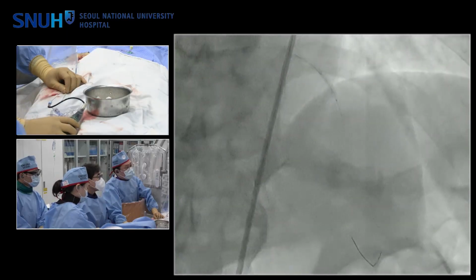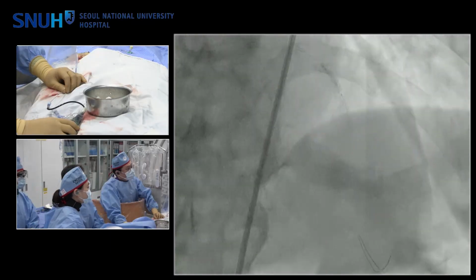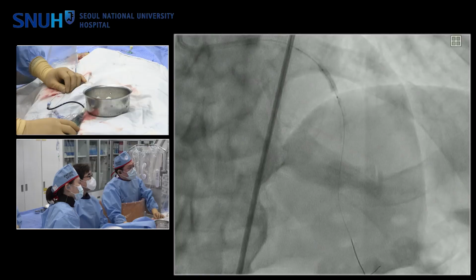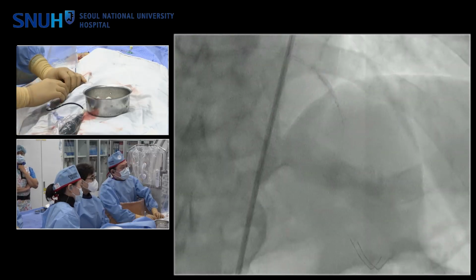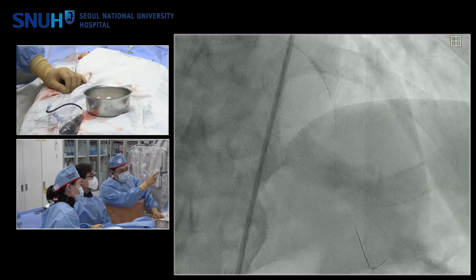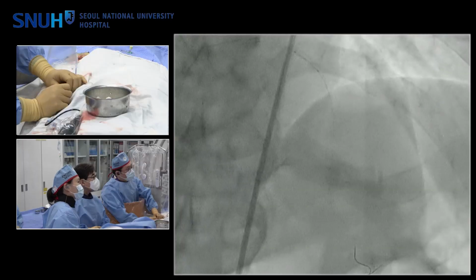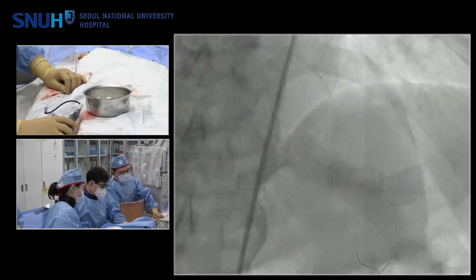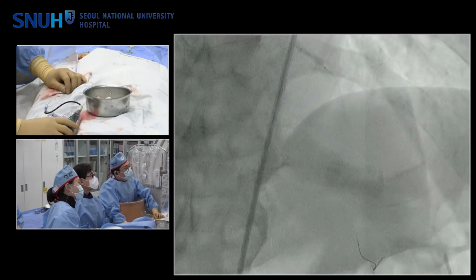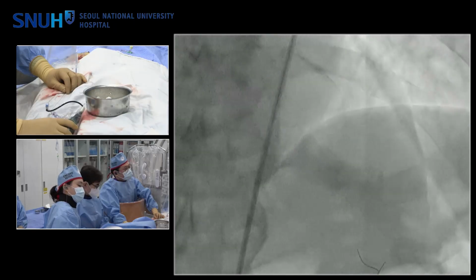Chair, can I make some comments as well? Personally, we can examine the lesion with IVUS or OCT. I prefer not to use rotablation. The passage of the stent is very easy. So the MLA in this case is 2.0 square millimeter. The 1.5 burr area is 1.75. So the 1.5 burr is smaller than the 2.0 MLA in this lesion. So rotablation is not working here, I think.